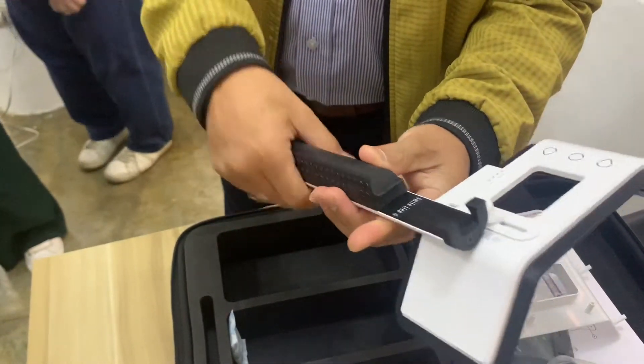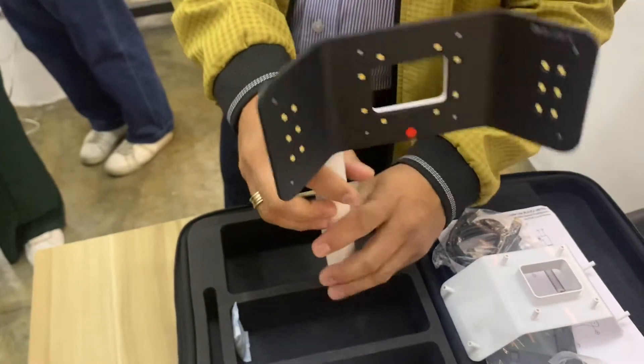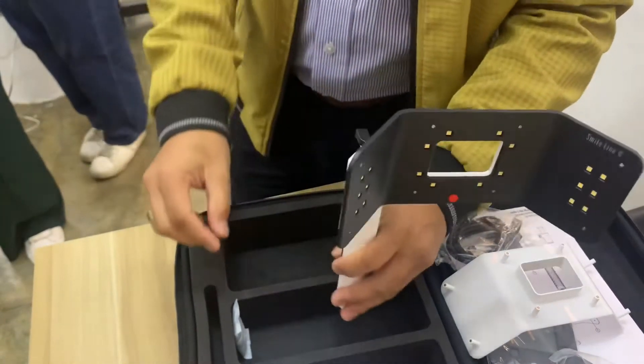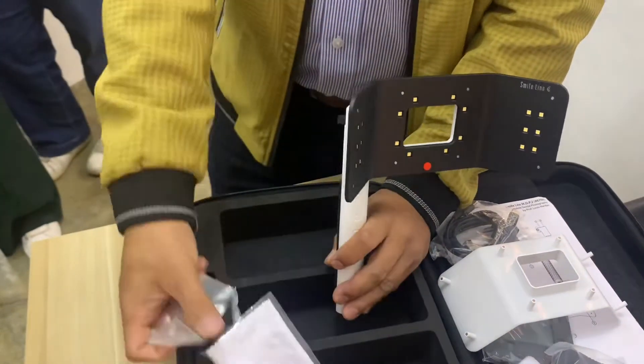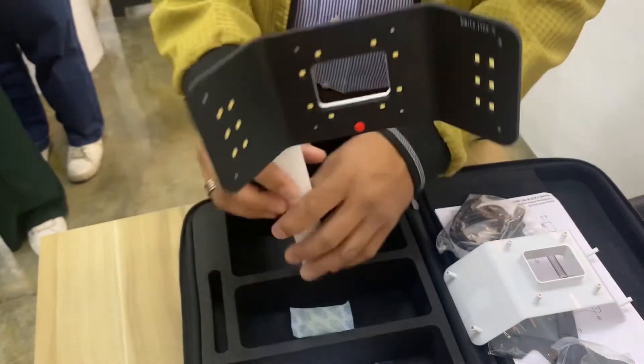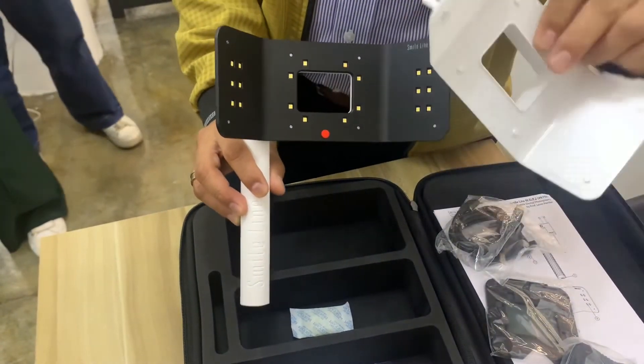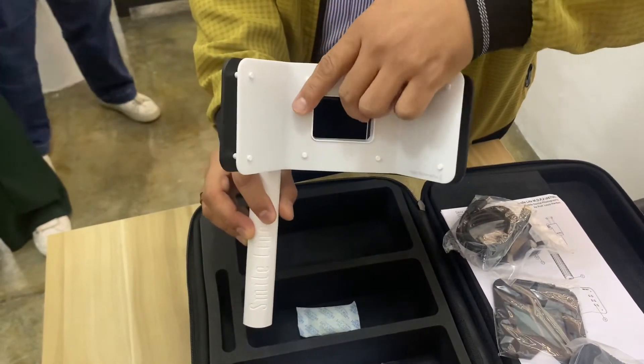We now have the handle — you can easily grip it here because it has a rubber type of holder, so you can put it there. And we have the screw, the wrench, and the cleaning cloth. This is a very good mobile dental photography system from Smile Line.